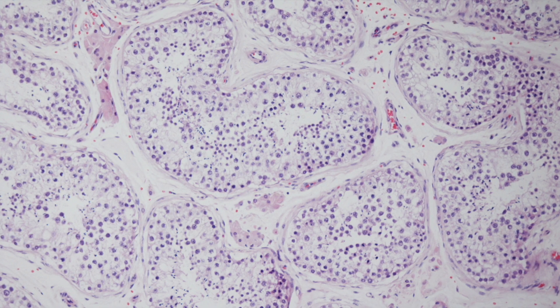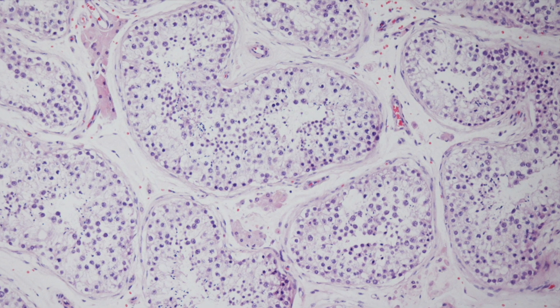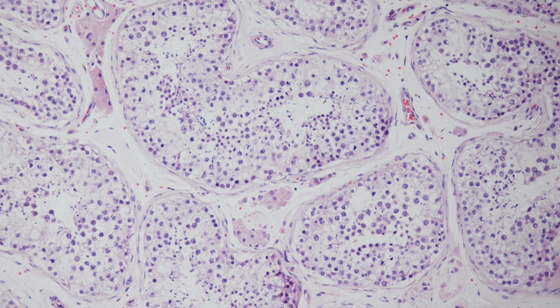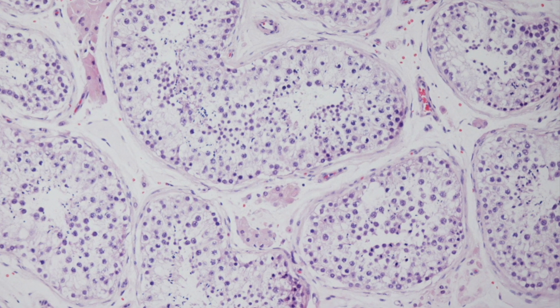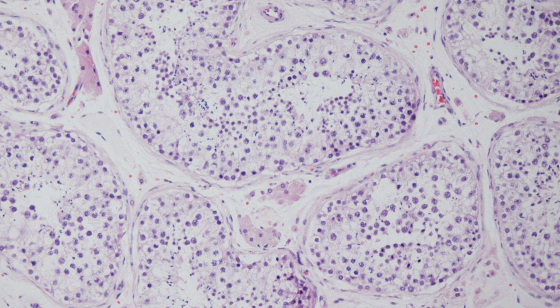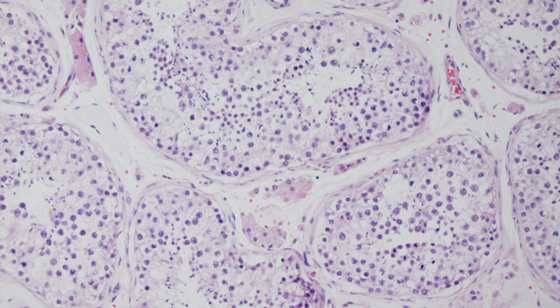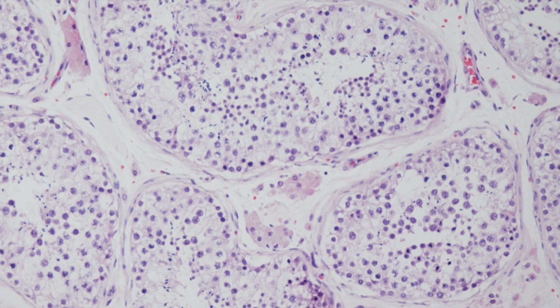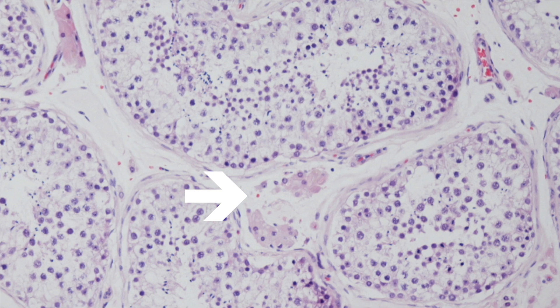This is the histological appearance of a normal adult testis. The seminiferous tubules show no peritubular fibrosis. They are present in normal numbers and there is full spermatogenesis with normal numbers of sperm and spermatids being formed. In addition, in the interstitium, Leydig cells are obviously present.